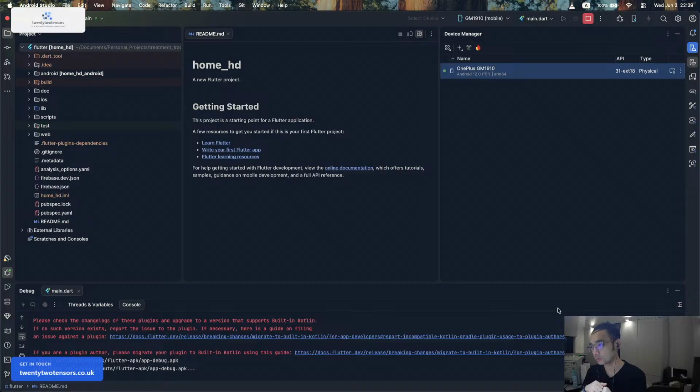So instead of trying to show everyone how to do it, I will package it into an app, because there is a lot of writing for the task, like inputting the in-session blood pressure and session information that the patient will need to use every day.